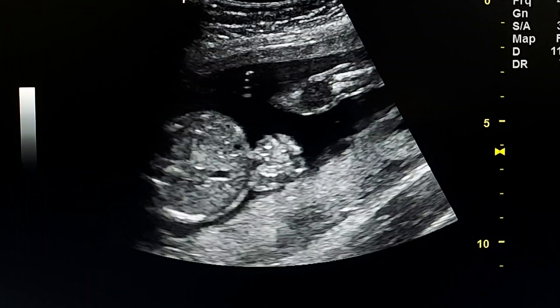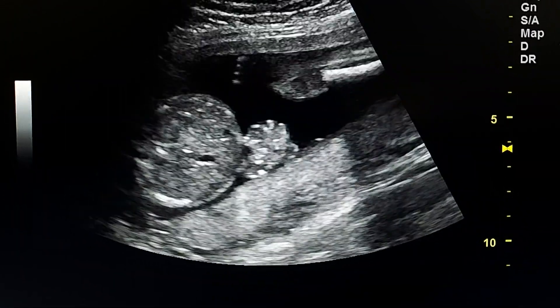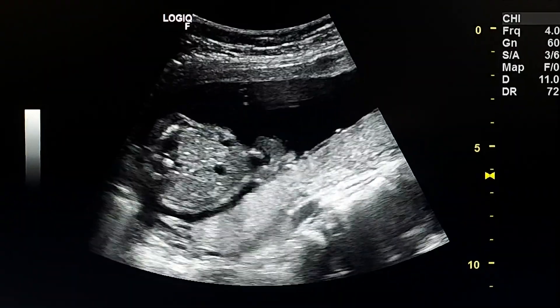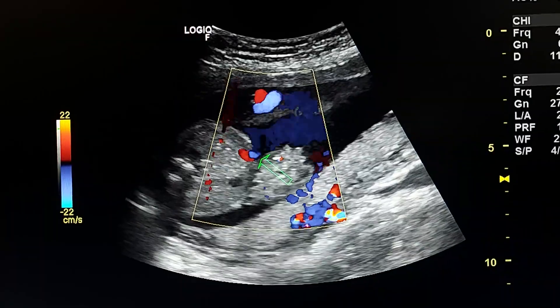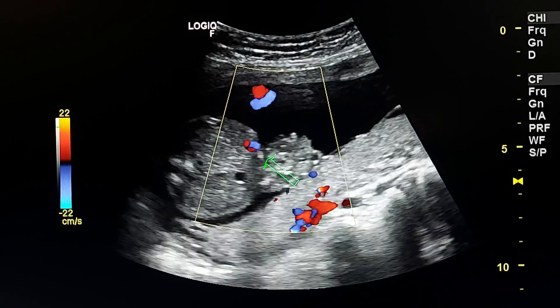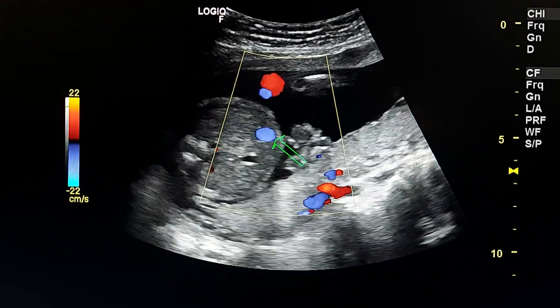Here we see the small bowel loops moving by pushing on the abdomen. Here we see the insertion of the umbilical cord with the umbilical vein and artery.